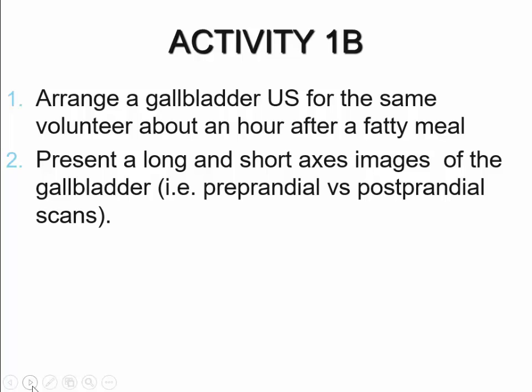Afterwards, find a way of getting your volunteer to take in a fatty meal, and then assess the gallbladder as you did earlier on. Present long and short axis images of the two images you've acquired for the preprandial and the postprandial scans.